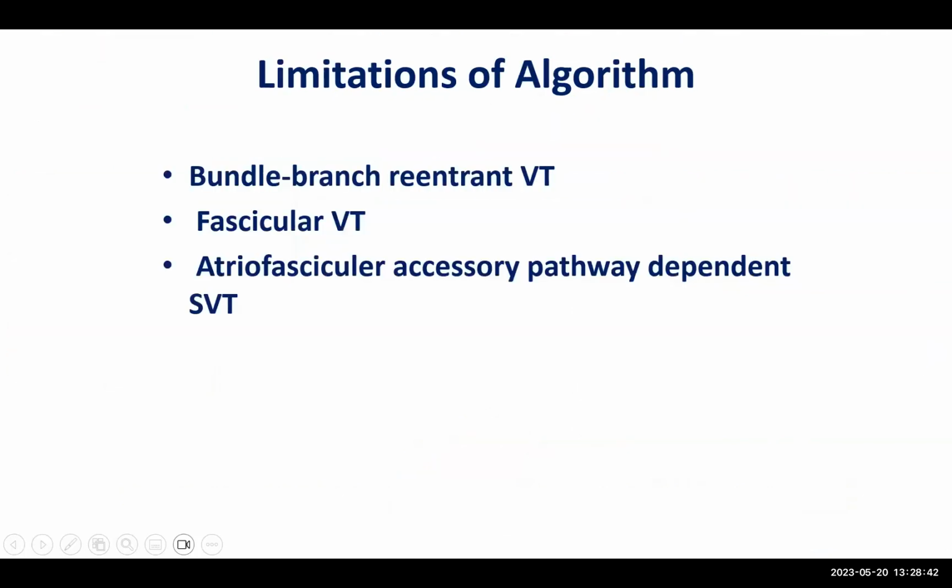There are limitations for all of these algorithms. You cannot use it in patients with bundle branch reentry tachycardia, which is common in dilated cardiomyopathy patients, not helpful in patients with fascicular VT, and not in patients with accessory pathways.